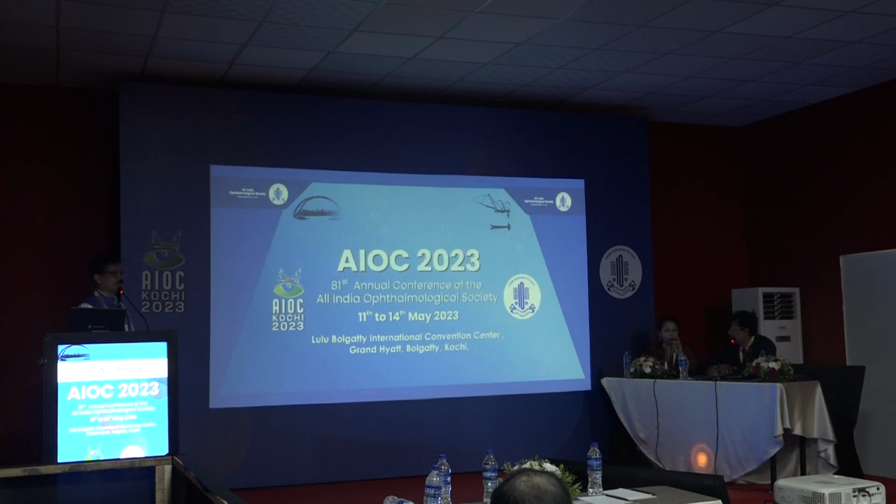Just one more point I would like to add, that most of the formulae work well for the normal range of axial length between 22 and 25. So all the formulae will give you the same measurement for the IOL power calculation. It's only for the extreme eyes, that is the short eyes and the long eyes, where you'll end up having post-op refractive surprises because of errors in IOL calculation. That is when you may have to repeat the measurements using different instruments, or use the latest, newer formulae. That will give more accurate readings.